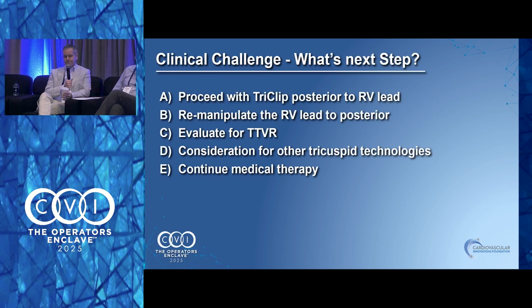I'll stop there. I think there are a lot of ways around it, but CT really helps with that. The TEE helps with that, but then the lead chronicity and your center's EP experience help a lot as well. Frosty or Lucy, do you want to comment on TR around this? Nadira asked a question.